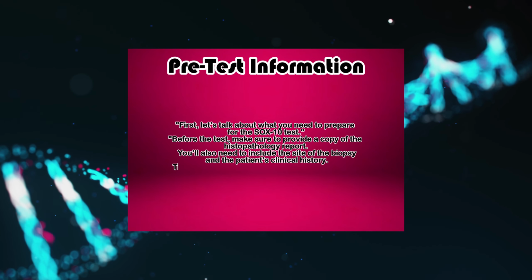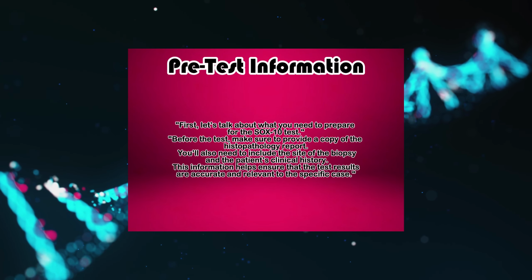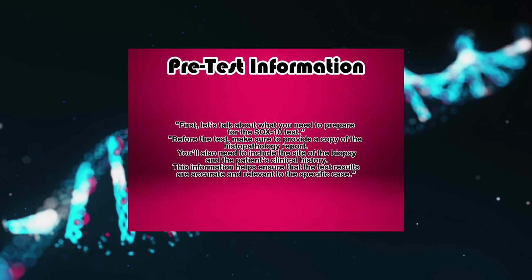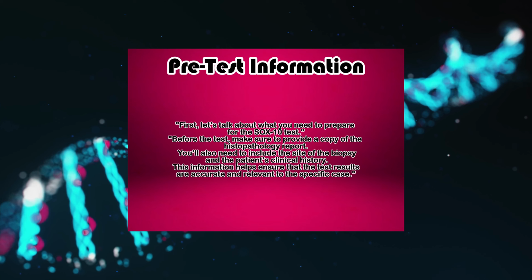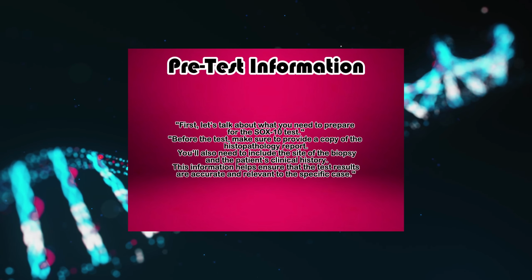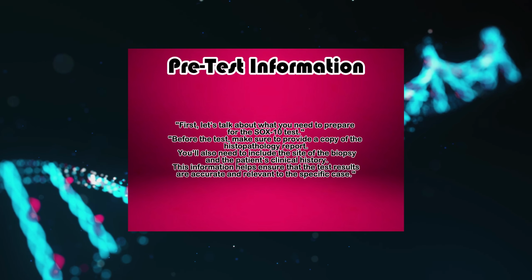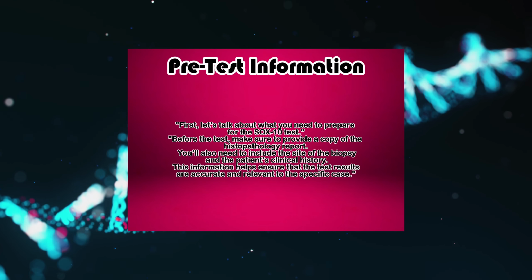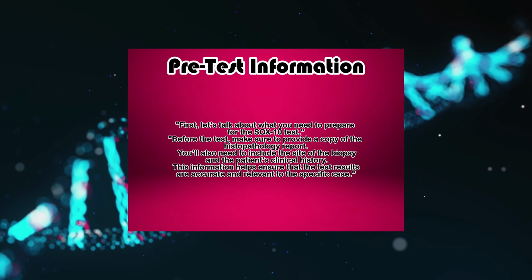Pre-test information. First, let's talk about what you need to prepare for the SOX-10 test. Before the test, make sure to provide a copy of the histopathology report. You'll also need to include the site of the biopsy and the patient's clinical history. This information helps ensure that the test results are accurate and relevant to the specific case.